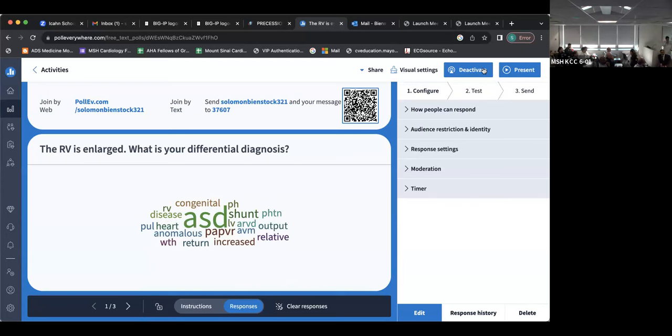So in your mind, start thinking anatomically, what can give you volume? That leads you to the next layer of testing, even within the echo itself, as to where you would look. I can add to that if you want, or somebody else can too, but you have to look for reasons of volumetric enlargement.